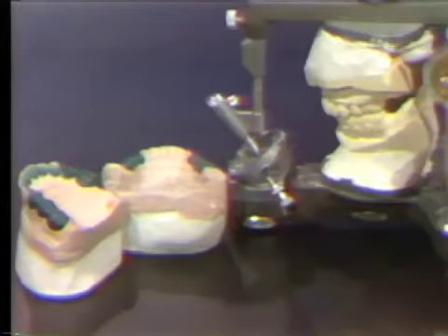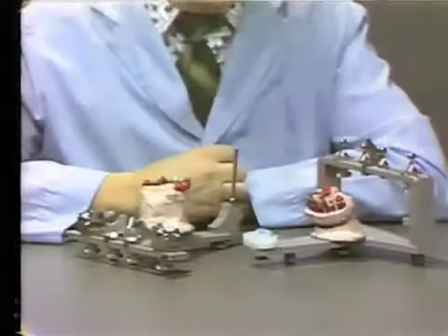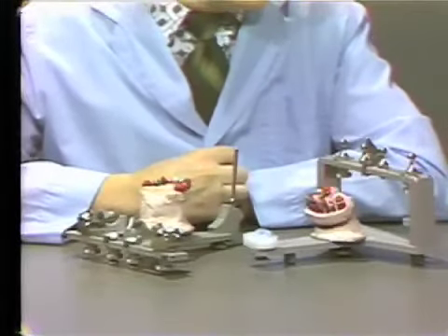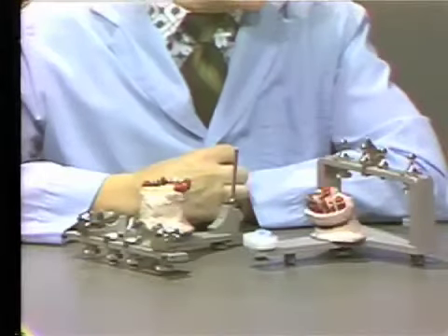We have the teeth prepared, impressions, models mounted on the articulator, and we have the case ready to send to the lab. The first thing we want to do is to make sure we have exactly accurate models to send to the lab. In order to demand top quality laboratory work from our laboratory technicians, a case must be complete and accurate.